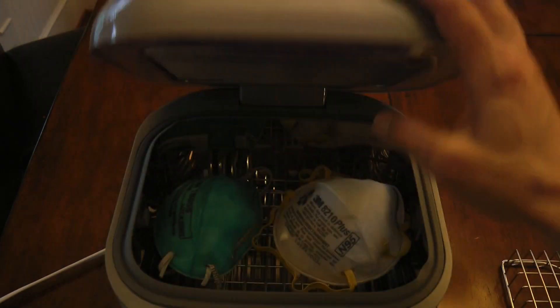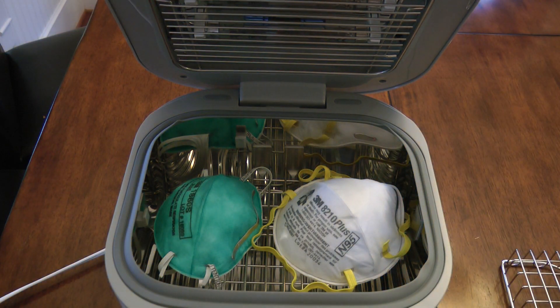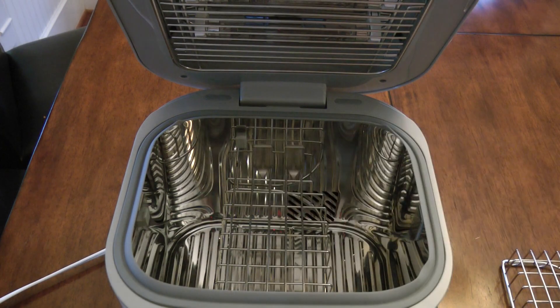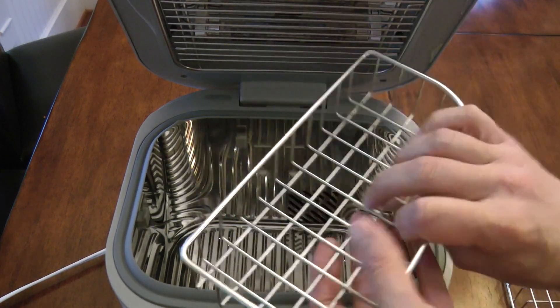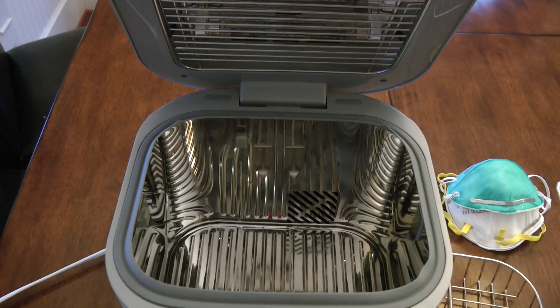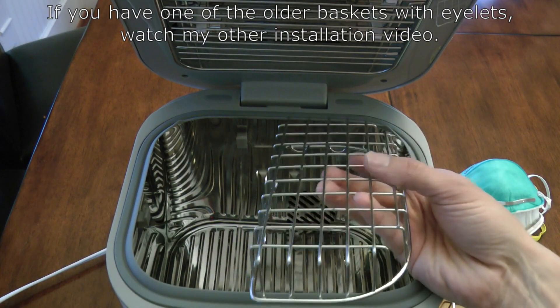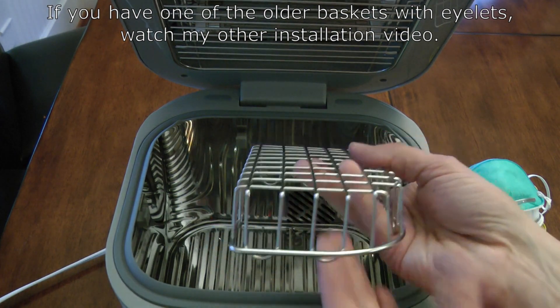So to use it for this purpose, you notice when I open it, it automatically turns itself off — it's got a safety mechanism, which I really like. But to use it for this purpose, you have to create this little shelf in here. It's very nice that the unit actually ships with this nice metal basket. I did a video previously where I showed how to install this basket into the unit and showed where all the hooks went.